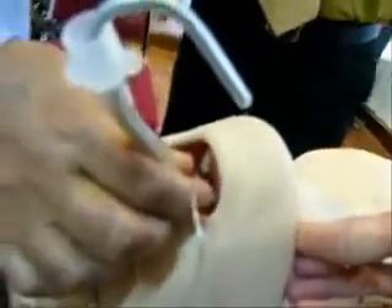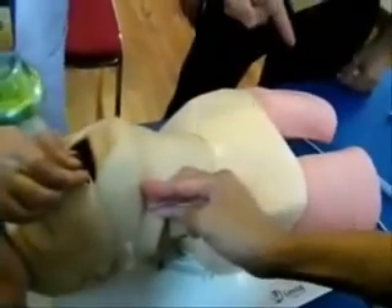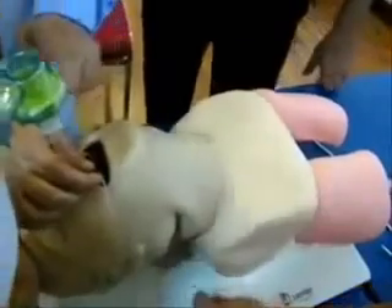You can make sure that the endotracheal tube is inside the trachea. Take out the bougie. Put the ambu bag back and see that the lungs get inflated — you can observe the rise or fall of the chest.